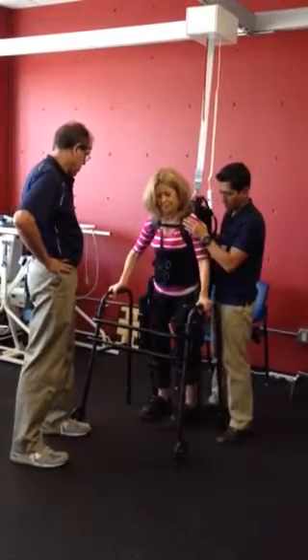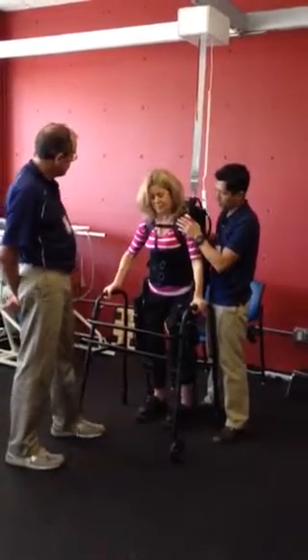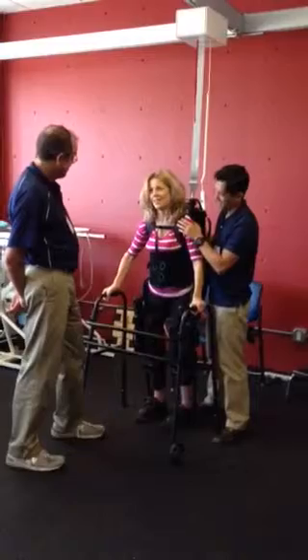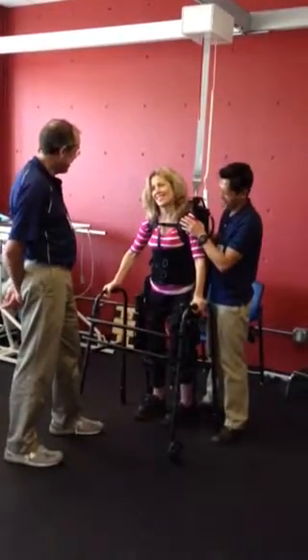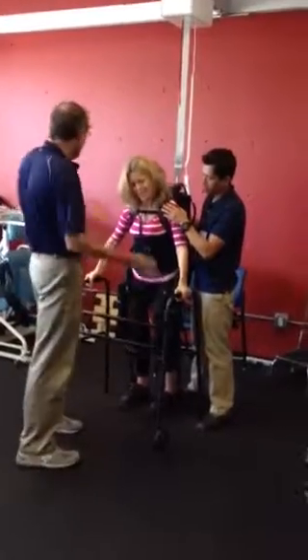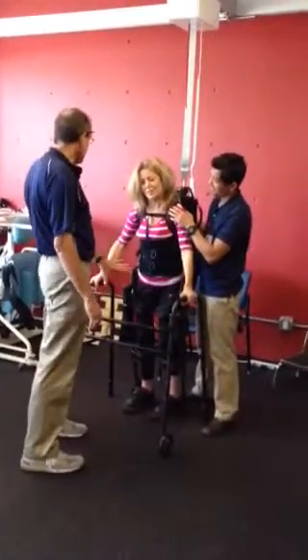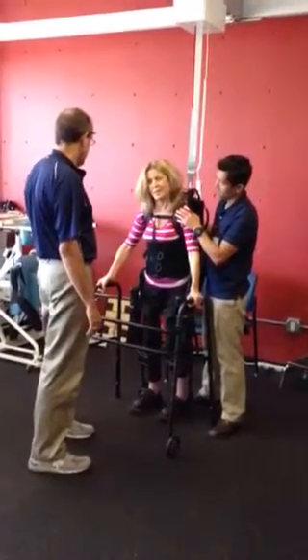Back to midline. Let's go right and forward. That's your fear? I can't fall — it can't. It's impossible. It can lean forward, but I feel like my legs are... The machine won't let it. It's locked in. It won't happen.